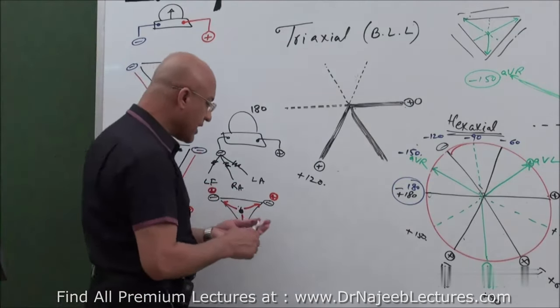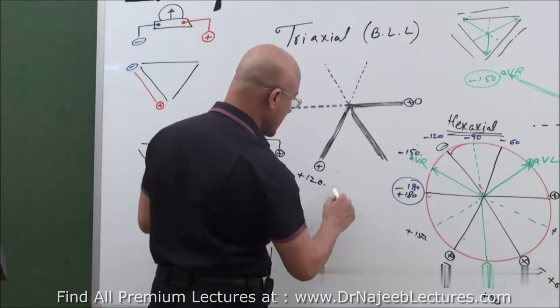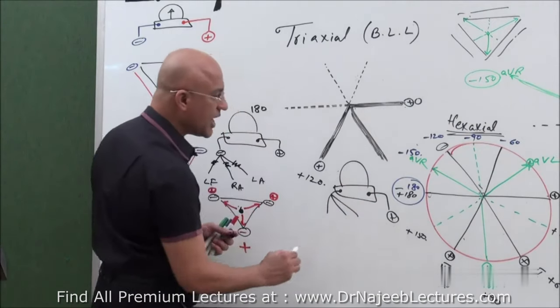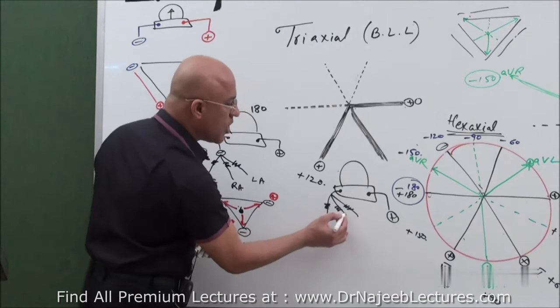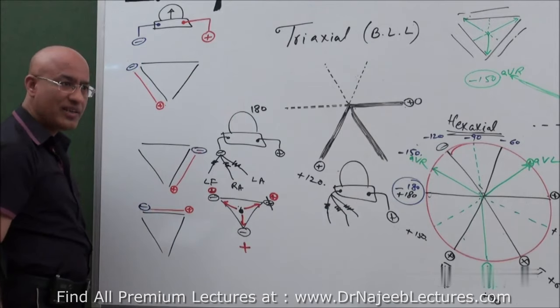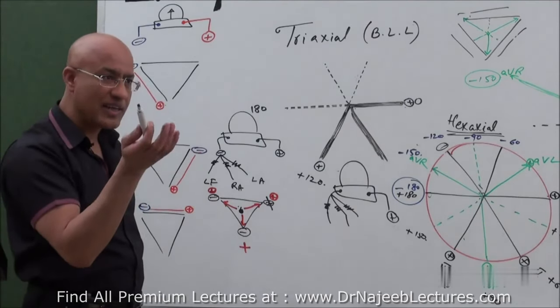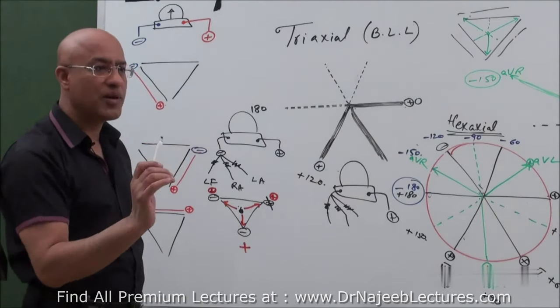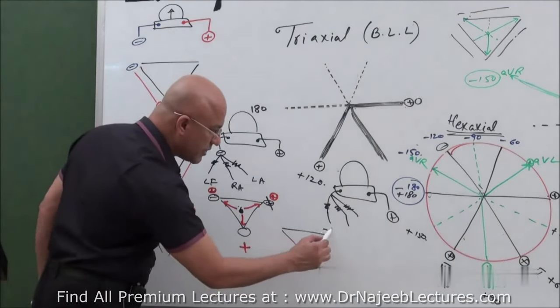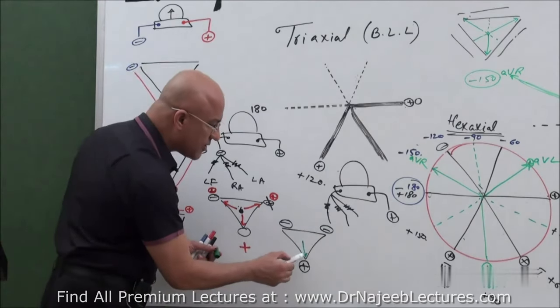Then Goldberger modified it. How did he modify this? He put the positive in the same way, but the negative, even though having three ends through resistances like Wilson, unlike Wilson, was cancelled wherever he put the positive. So the axes of the leads were the same, but the voltage was augmented. In this way we got augmented limb leads. If you put negative here and here and positive here, what is this? AVF.